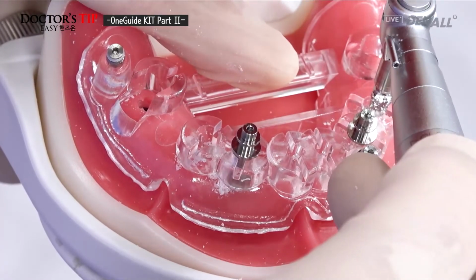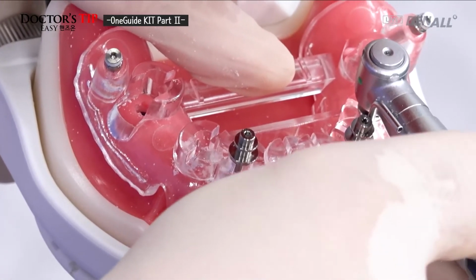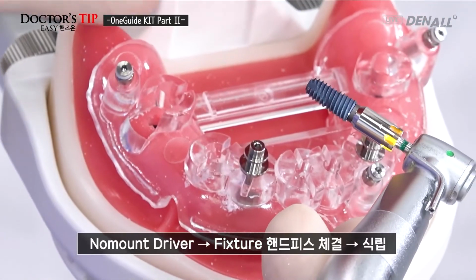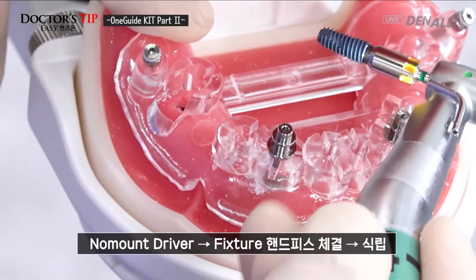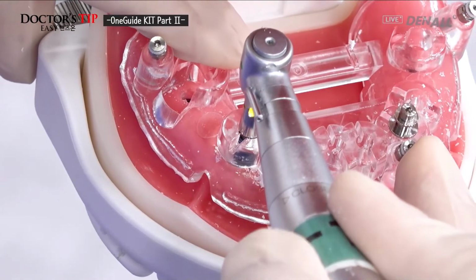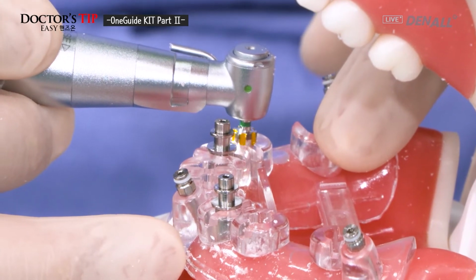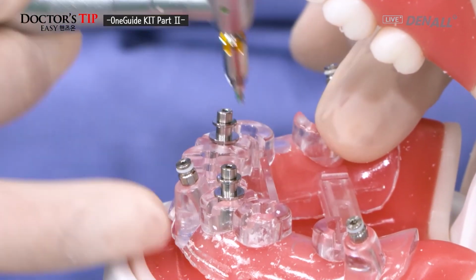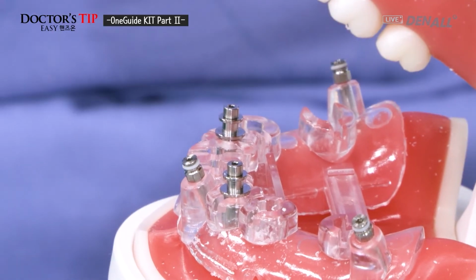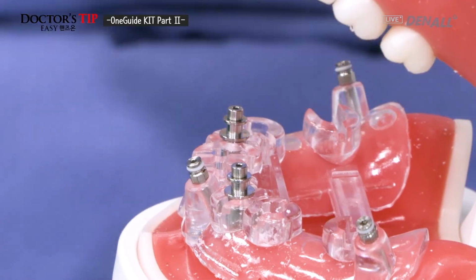Final drill. Do it the same for this side. 4.5 by 10 millimeter. Check if it is placement mode. And on number 44, implant is going to be connected. Approximately 80%. Put the fixture. And then, if you look, fixture driver regular size is chosen.